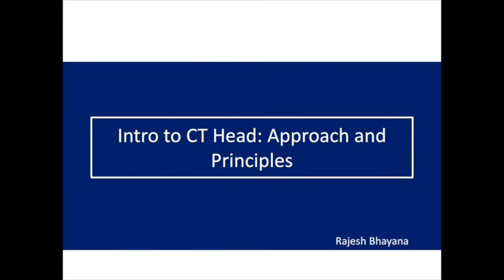This talk is intended to serve as a good introduction to CT head. If you're a new radiology resident, you must understand the basic concepts presented here so that you have a strong base to build on moving forwards.